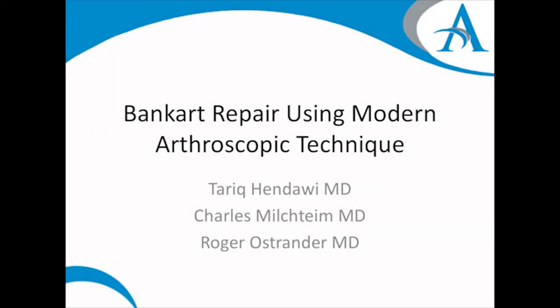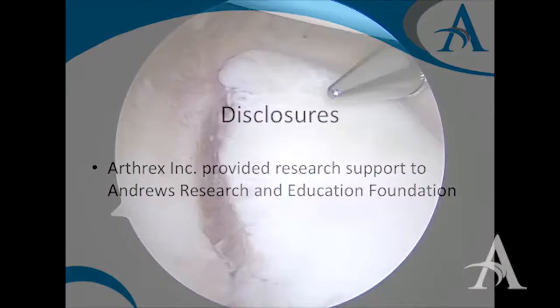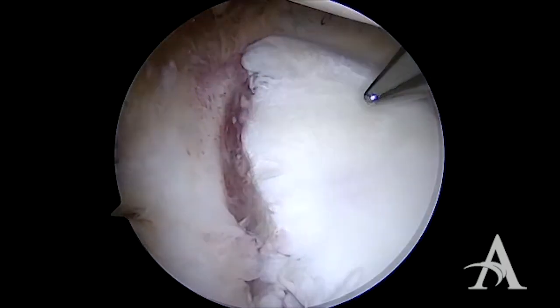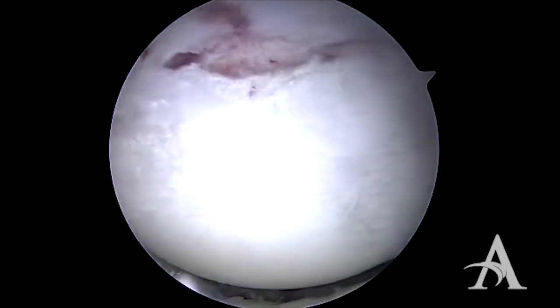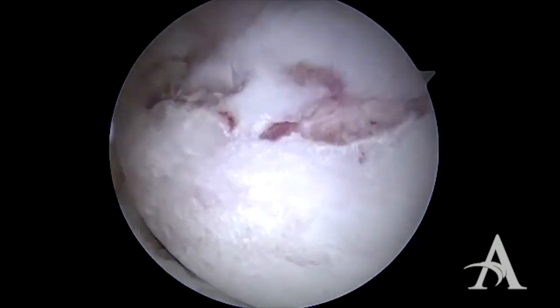Bankart repair using modern arthroscopic technique. The Bankart lesion can be visualized from our anterior cannula, showing the anterior labrum stripped from the front of the glenoid. There was a small amount of glenoid erosion; however, this patient had a very small Hill Sachs lesion, and we felt that this was amenable to arthroscopic repair.